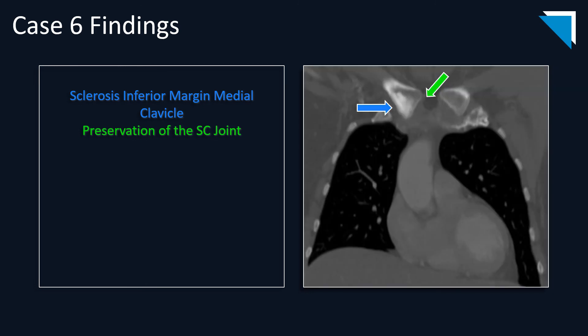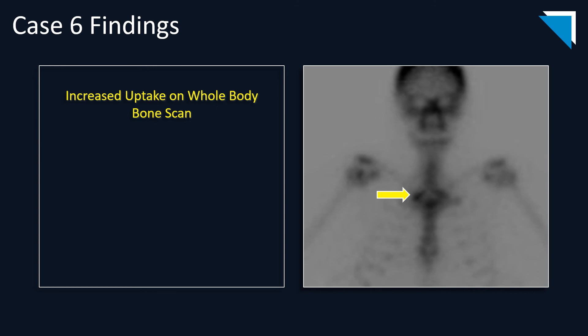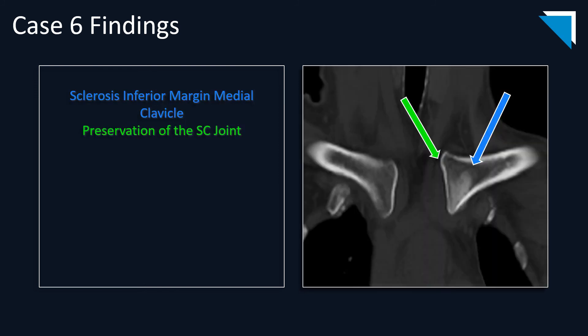On a coronal CT image, there is sclerosis along the inferior and medial margin of the clavicular head with preservation of the sternoclavicular joint. A whole-body bone scan was performed to exclude metastatic disease, which revealed increased uptake within the medial right clavicular head with no additional areas of uptake. A different patient demonstrates sclerosis within the medial left clavicular head with preservation of the sternoclavicular joint.